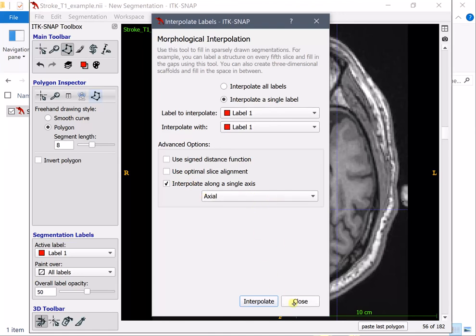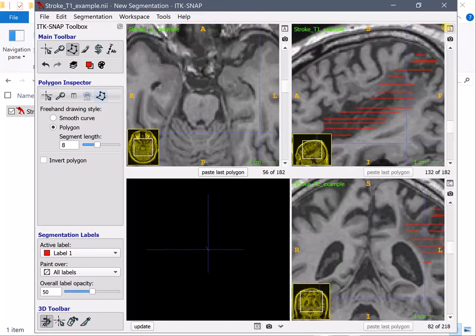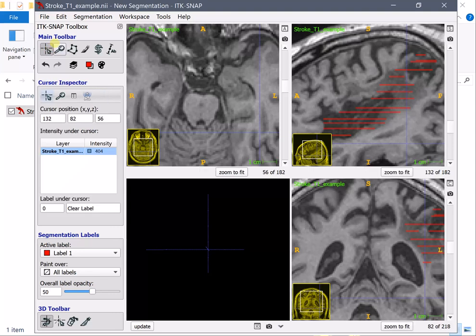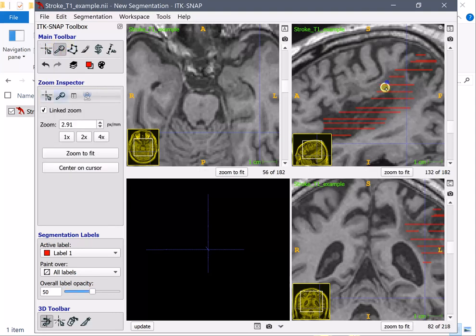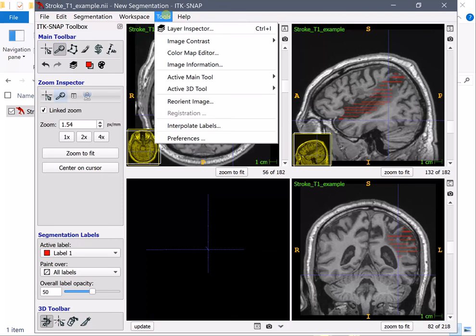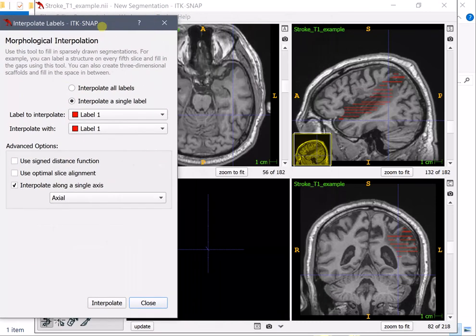And before I show you that let's switch to the three dimensional view to see how the whole lesion shape will change.